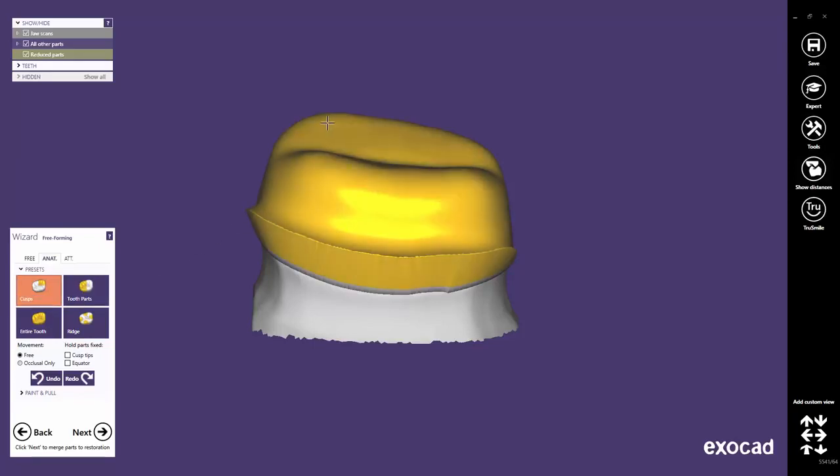Note: for offset copings or wax-ups, the software will not know the location of the cusp. Choose Tooth Parts to edit the mesial, distal, buccal, or lingual side, wherever you click on.